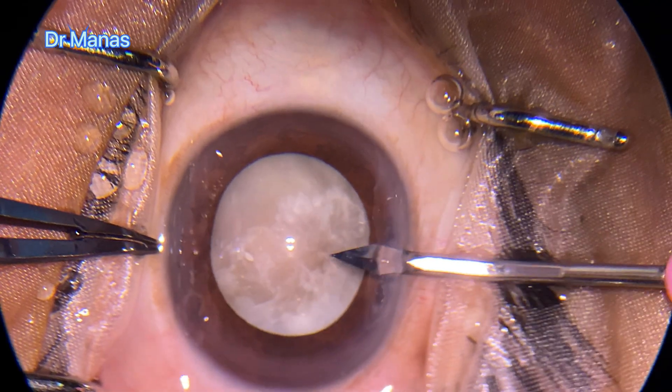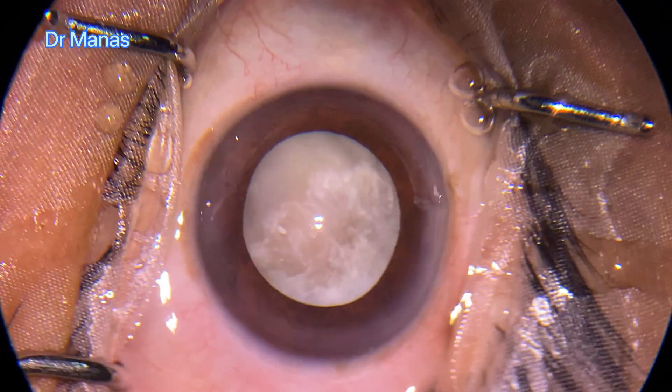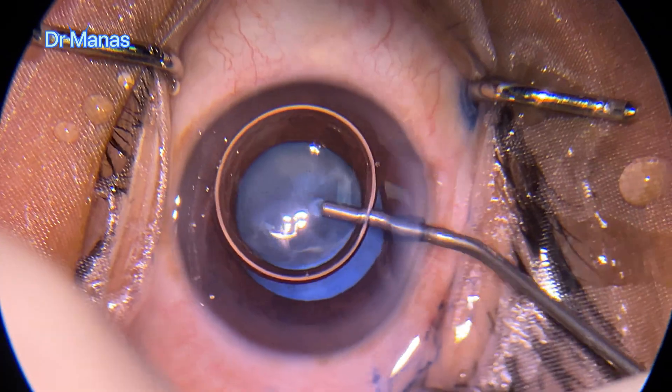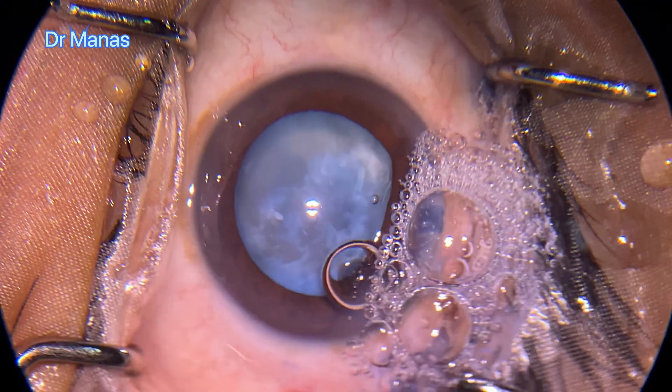Hello everyone. This is a case of phacoemulsification in a very hard, mature cataract. Looking at the picture, you can see it's a long-standing cataract — the patient waited almost more than 12 years to undergo this surgery.